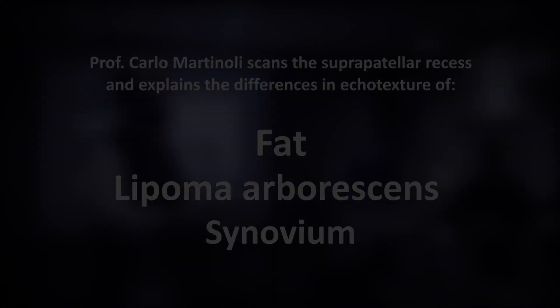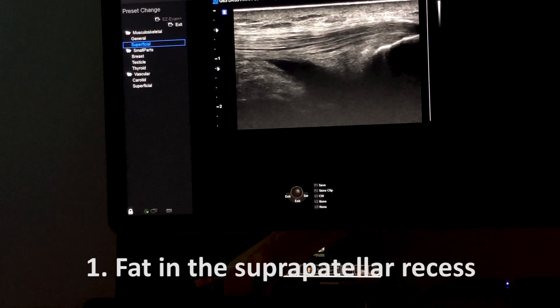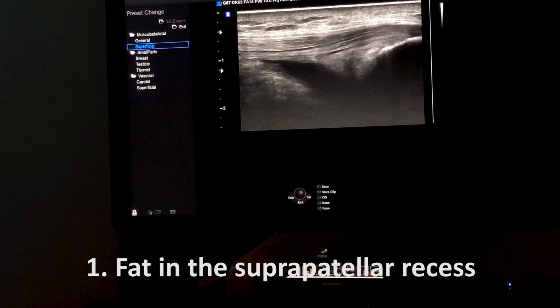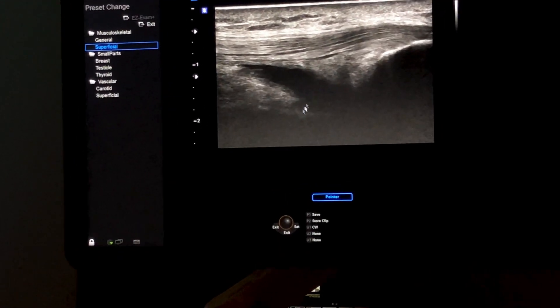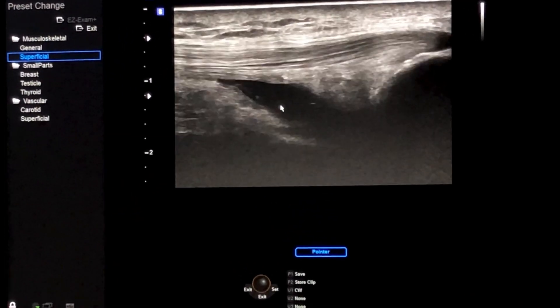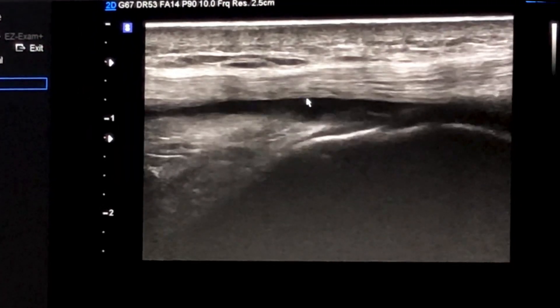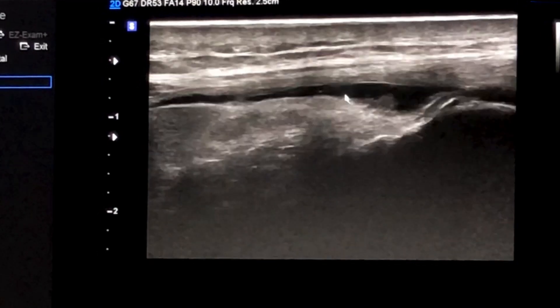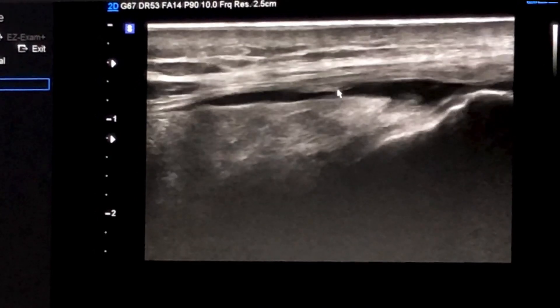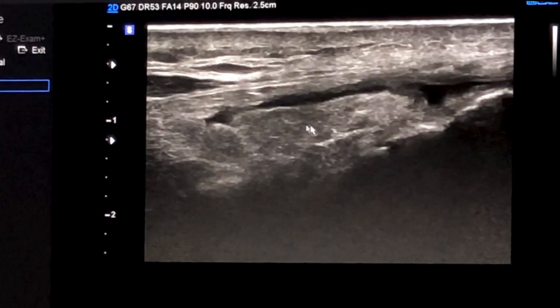In this case, we see nice quadriceps, some effusion — you see this thing in the horizontal part of the joint. We check the fluid here and now I change the position to move the fluid more laterally, and we see here the fat pad.